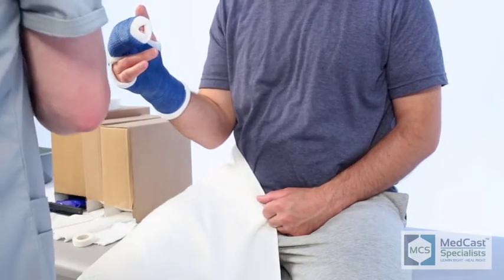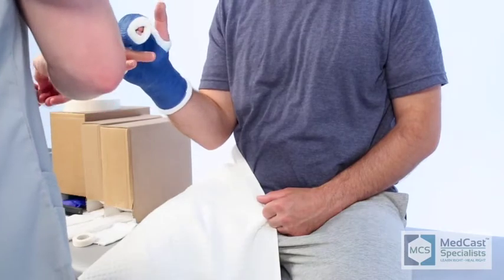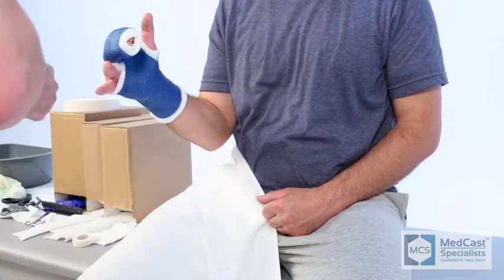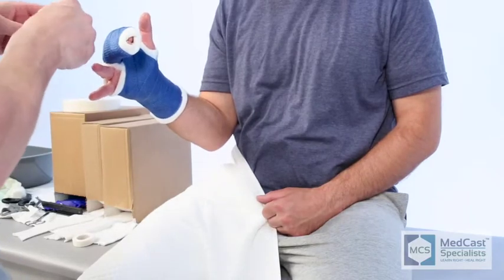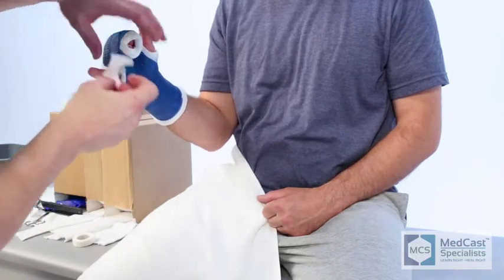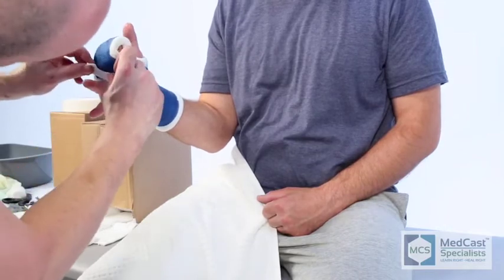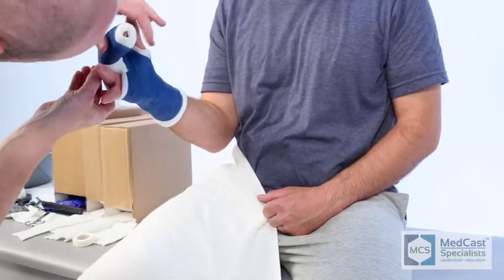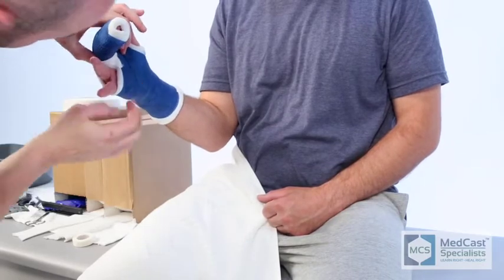It's important to make sure you have them in the correct position right when you first start wrapping your cast material, because there's been a few times where I've found that the patient was extended a little bit far. Then when you go to flex them into that position, a lot of times you'll get a crease right there on the volar aspect, and it's always going to dig in on that side. So make sure you get them in the correct position before you start wrapping your fiberglass material.